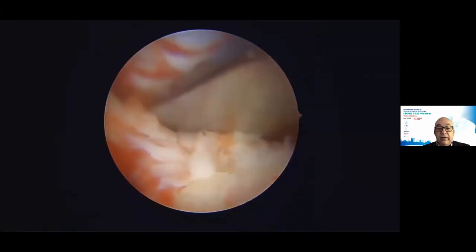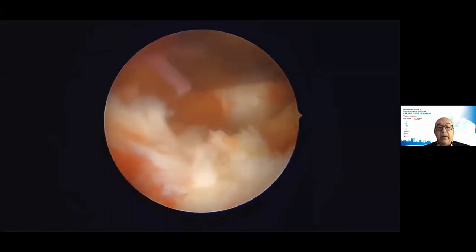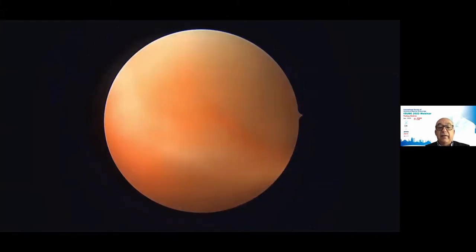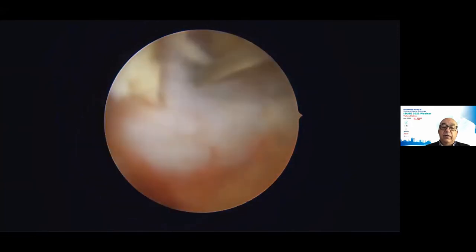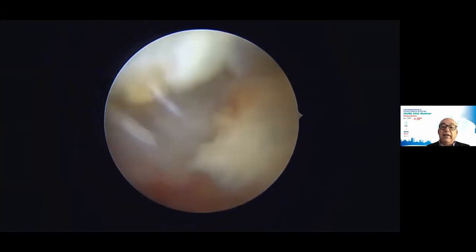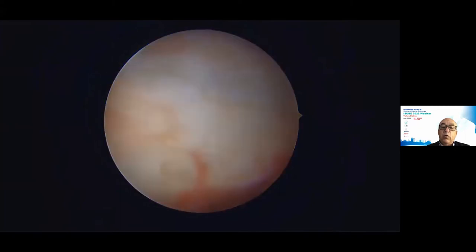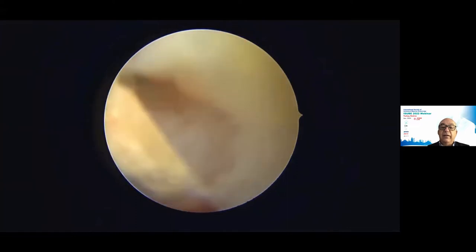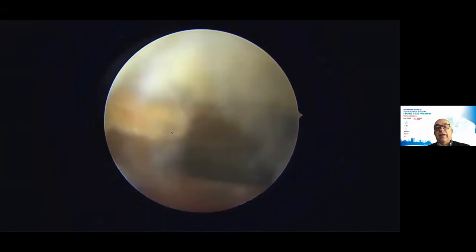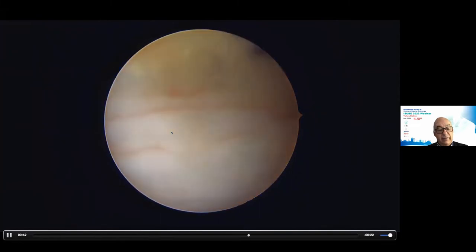Here, you can see in the lateral part, the nerve is decompressed, and this technique allows us to decompress the other side over the top. You can see here the canal decompressed, and the other side, the right side, because we began on the left side, completely decompressed. You will see the fat tissue of the right side, and now you can see the right side already decompressed.